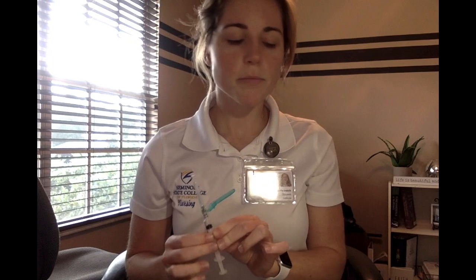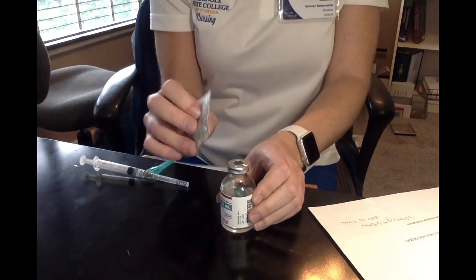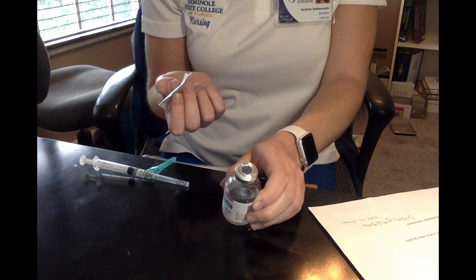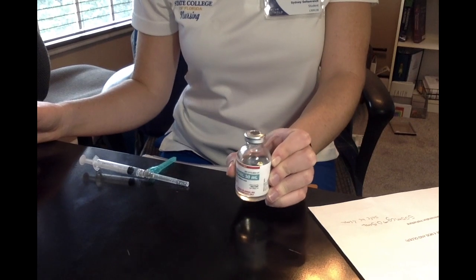Okay, and you want to make sure you're not touching the inside part of the plunger. Okay, so do that. I would alcohol swab first the top of the vial for 30 seconds, after popping off the top, so let that air dry. You want to make sure you get that pretty good so you don't introduce new bacteria into the vial.